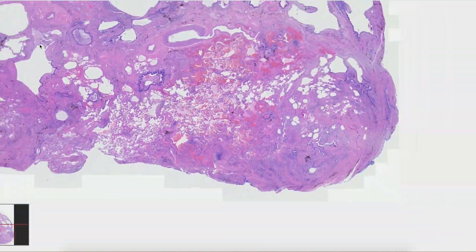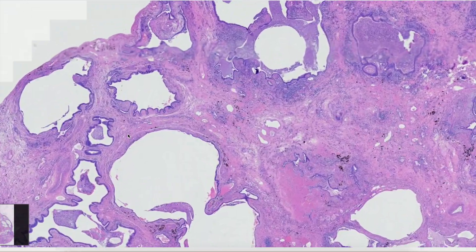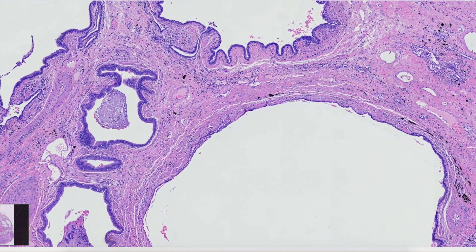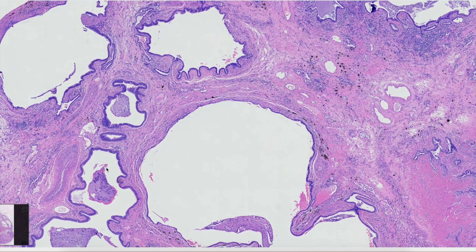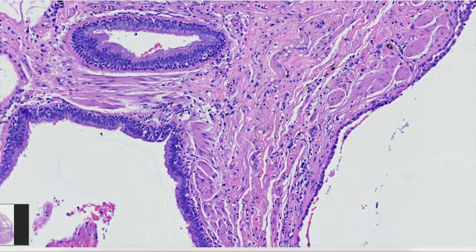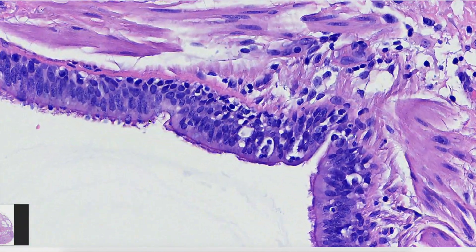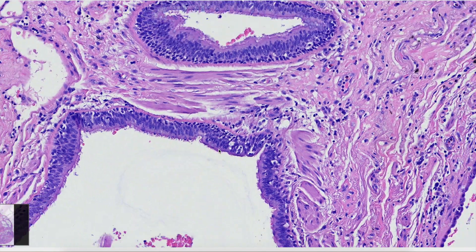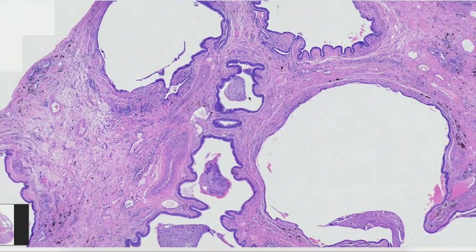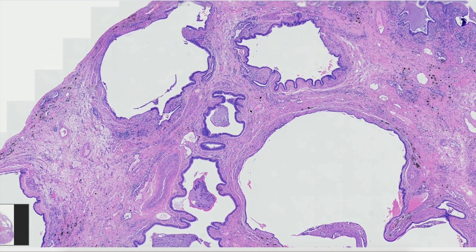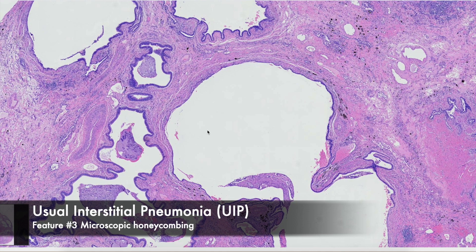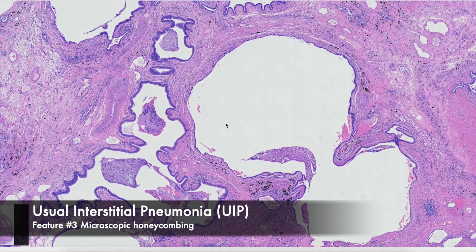In the abnormal areas, we see dense fibrosis and loss of the normal alveolar architecture. Instead, we have cystically dilated spaces lined by metaplastic bronchial-type epithelium, with cilia and terminal bars visible. These cystically dilated spaces stacked on top of each other with intervening areas of fibrosis is what we call microscopic honeycombing.